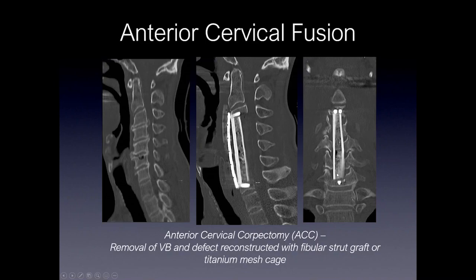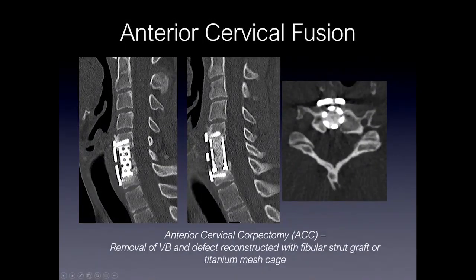And this is what it looks like on the coronal image. Here's an example of a titanium mesh cage — a corpectomy was performed, this cage is placed, and within the cage is bone graft material, which you can see centrally. Also on the axial image, you can see bone graft material, as well as streak artifact from the metallic titanium cage and an anterior plate.